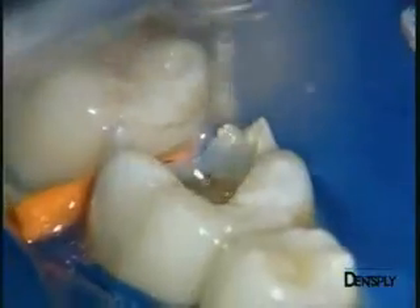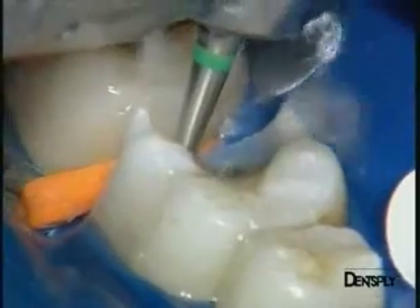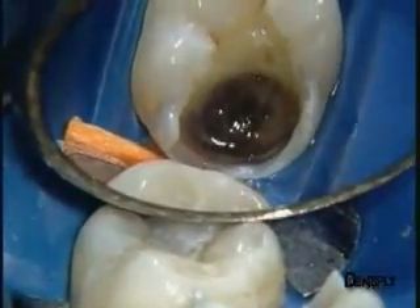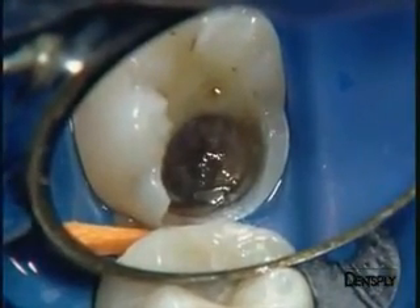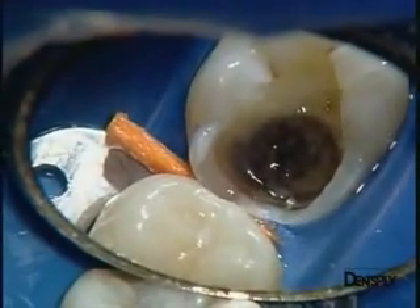The wall will therefore be prepared and the burr will let it burst into pieces. This is not really inconvenient as the intention was to rebuild it anyway. We remove the whole carious lesion — all the decayed dentine — with a round burr mounted on a contra-angled handpiece at low speed. The carious lesion is then cleaned and we prepare the rest of the cavity by preparing the cusps. It is clear that we will have difficulty restoring a satisfactory contact point in this zone, but it will be a determining factor in the functional integration of the restoration.